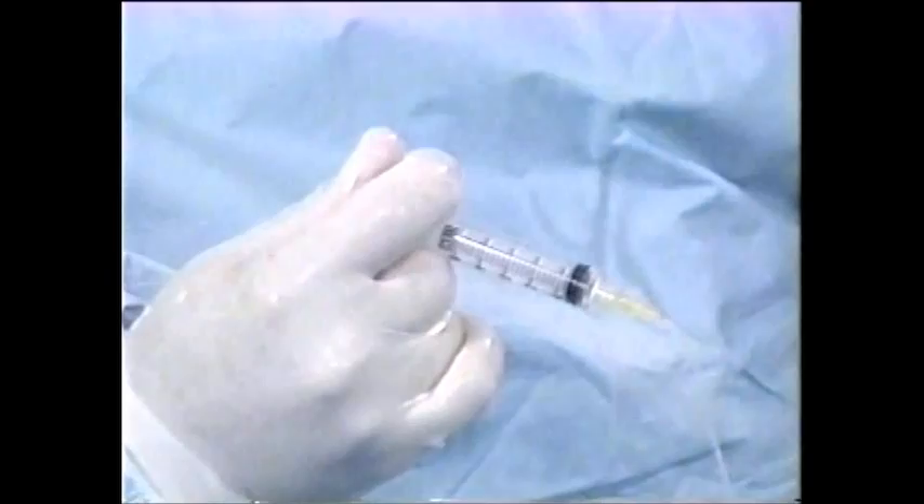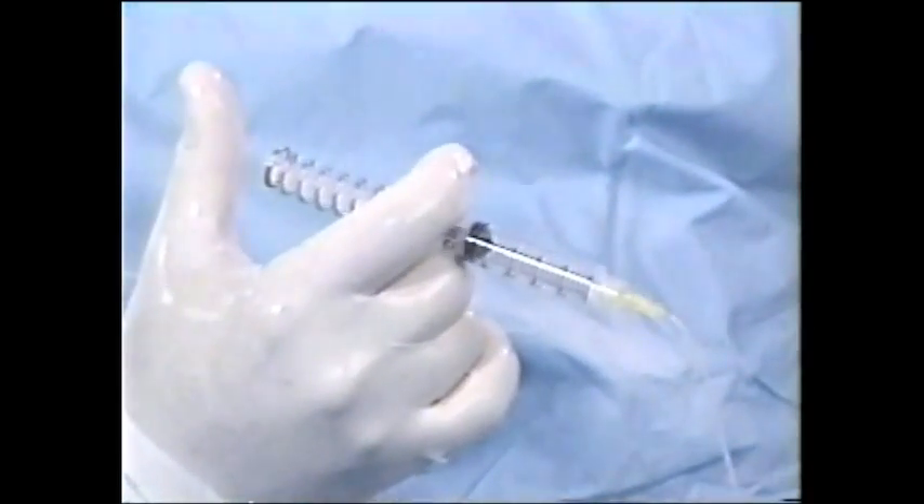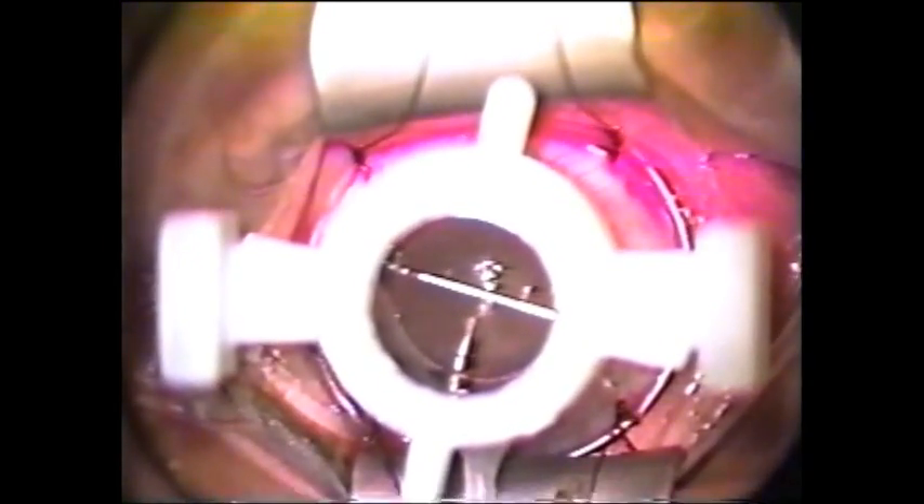Position the trephine in the desired location by looking down through the trephine from above and centering the crosshair. Press down slightly on the cornea to seat the instrument and release the plunger abruptly. Wait approximately 30 seconds for the suction to become fully effective.